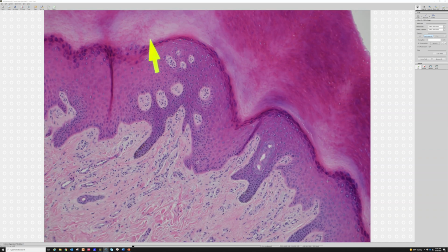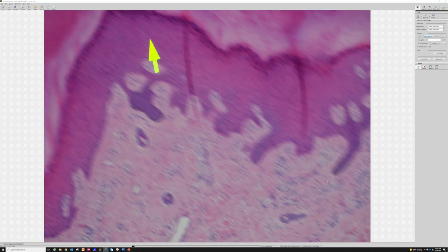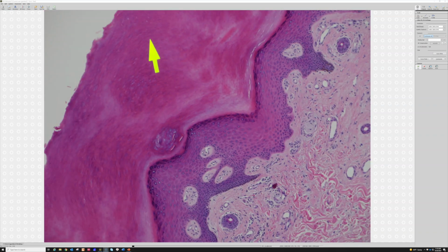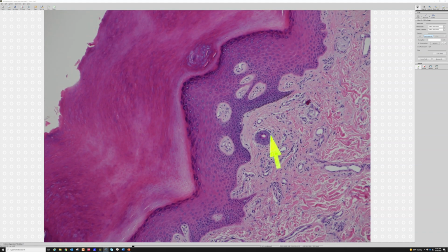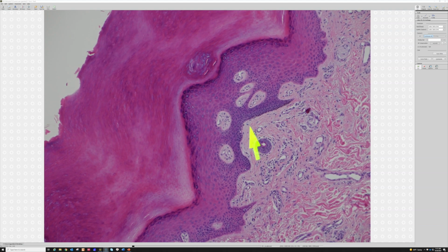So in palm and sole skin, you have a lot of eccrine glands and, of course, a lot of eccrine ducts. And also, it's kind of cool. Here's the duct down here, kind of cut at an angle, so it looks like it's coming straight out of the tissue at us. But this one probably swirls around and connects up somewhere deeper in the tissue.